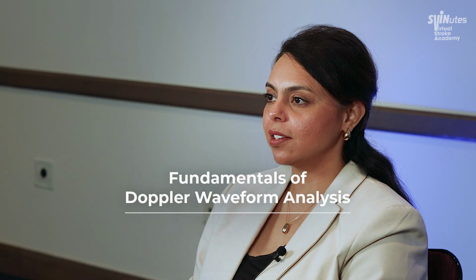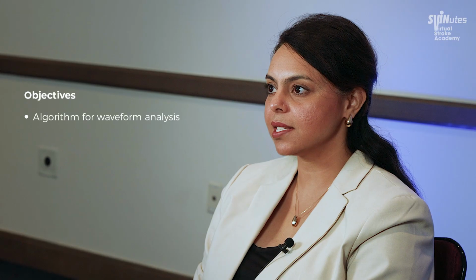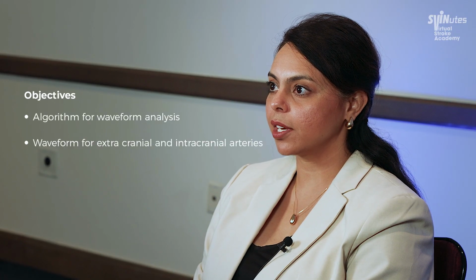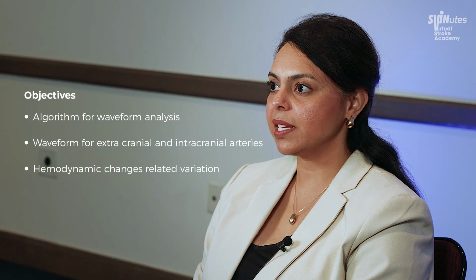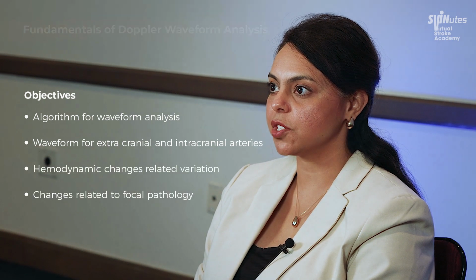Doppler waveform analysis, also known as spectral analysis, is essential for interpretation of vascular studies. Waveform can vary widely based on systemic hemodynamic factors or focal pathology. In today's review, we'll focus on an algorithm for waveform analysis, then review the normal waveform pattern for extracranial and intracranial arteries, and then look at some examples of hemodynamic as well as focal pathology-related waveform changes.